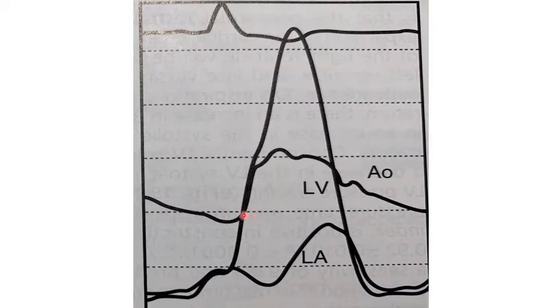So this is the point for you to differentiate. When the aortic pressure rises with the LV pressure initially, and then an obstruction occurs, it is suggestive of dynamic obstruction. In a patient with fixed obstruction, from the beginning there will be a gradient between the aortic pressure and the LV pressure, and there will be delayed closure of the aortic valve.